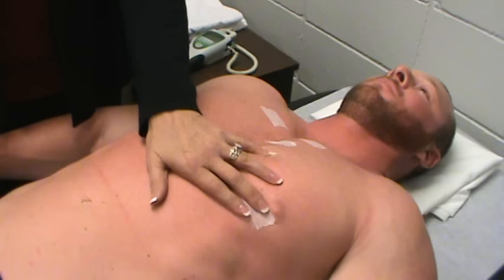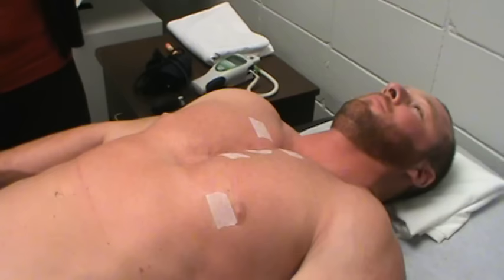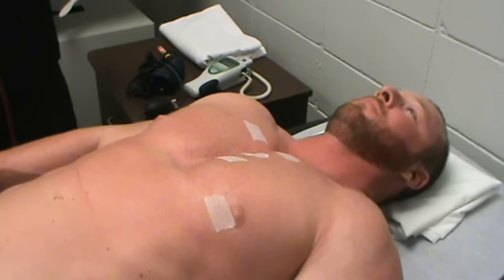Okay? I'm going to listen with both my diaphragm and with my bell so that I can make sure that you don't have any kind of heart murmurs or any abnormalities. Okay? First, I'm going to listen with my diaphragm.